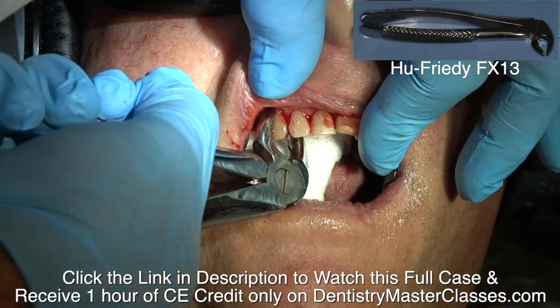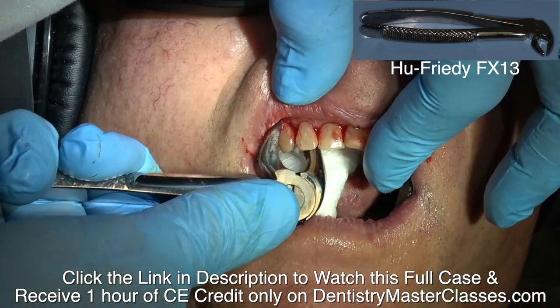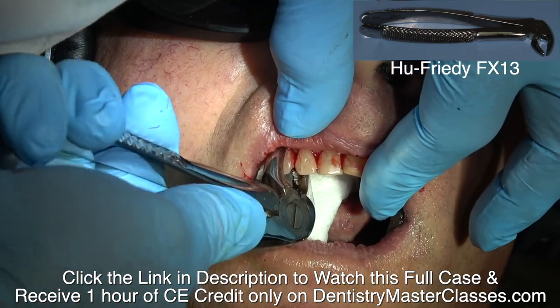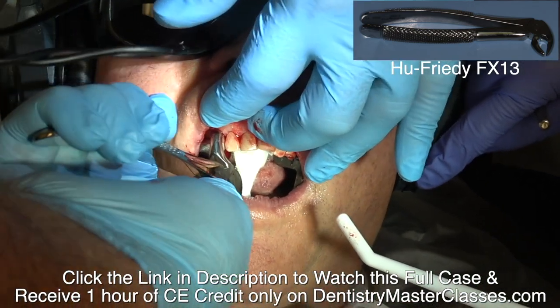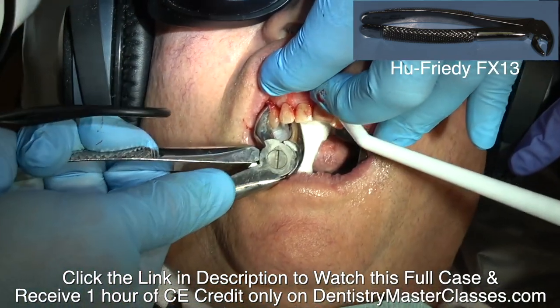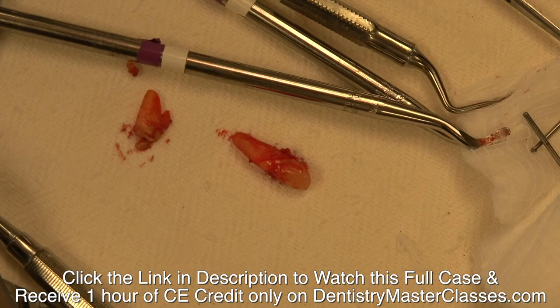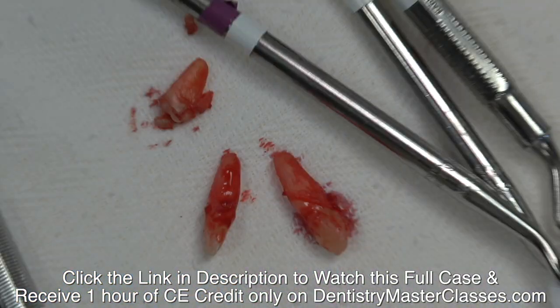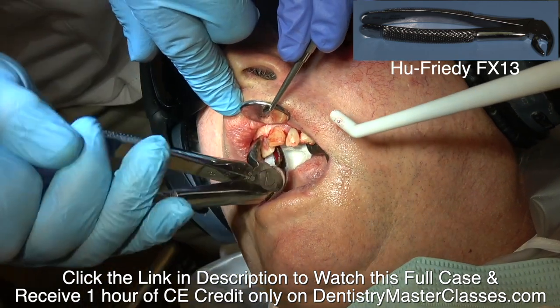I'm trying to get some elevation here, mesial-distally, and unscrewing those teeth again with the FX-13 forceps. If you don't have any of those, be sure you get some. They're really nice for single-rooted teeth, or if you section a molar into two or three pieces, removing those pieces as single-rooted teeth.